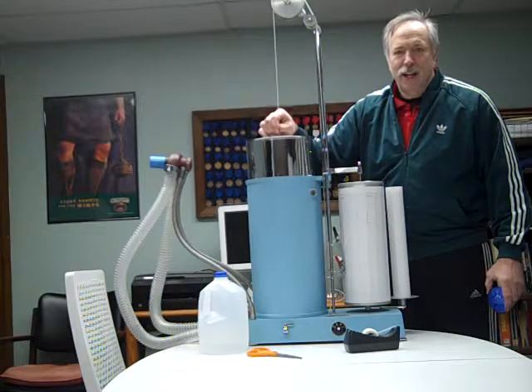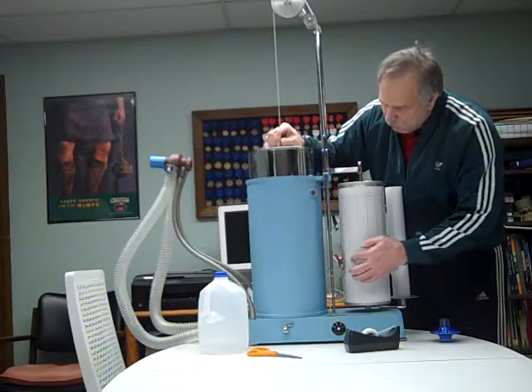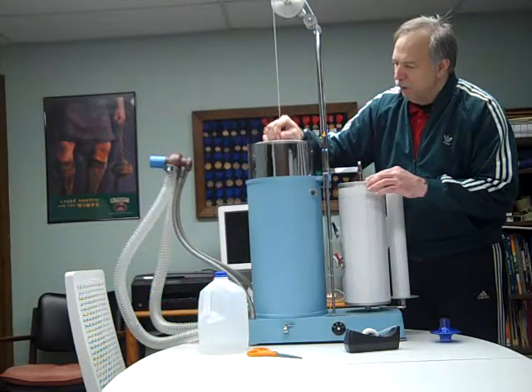You can actually see what a liter looks like. As the bell is going up and down, it's writing on a kymograph drum that is spinning and it measures the volumes that are obtained.